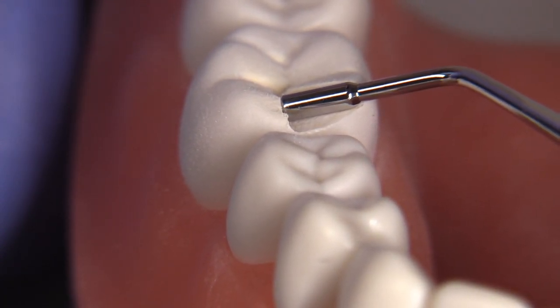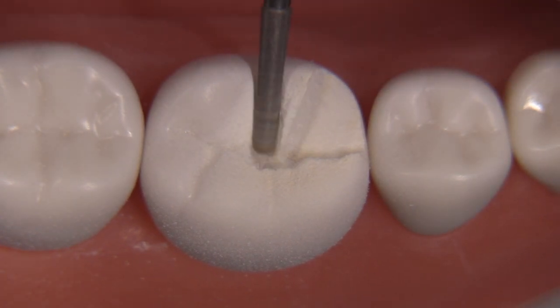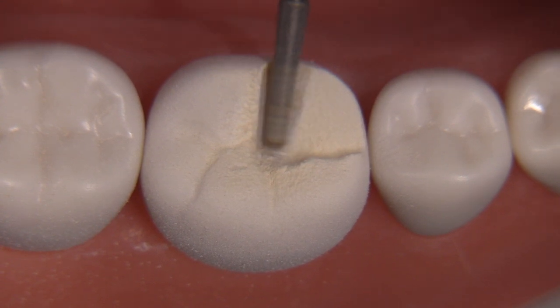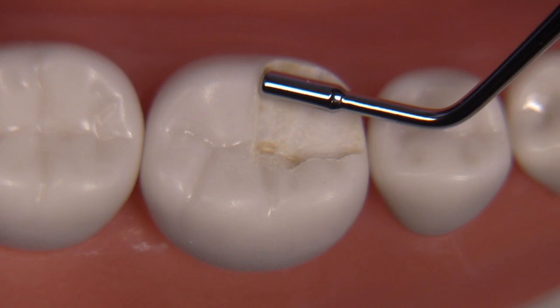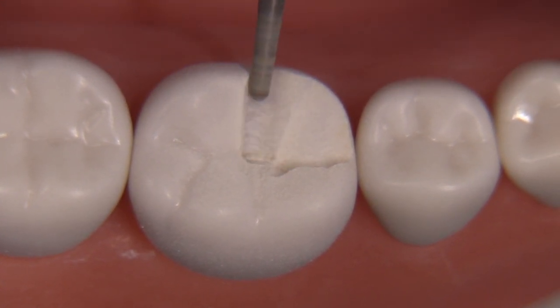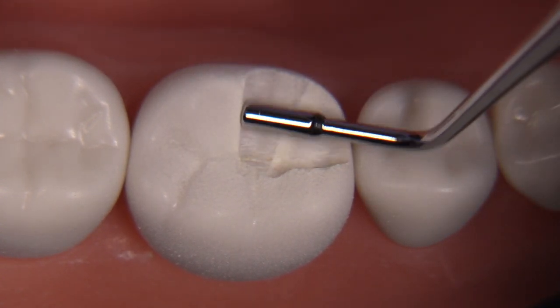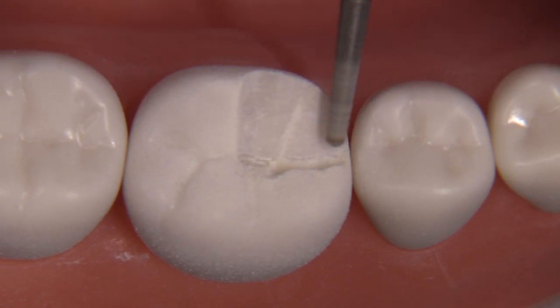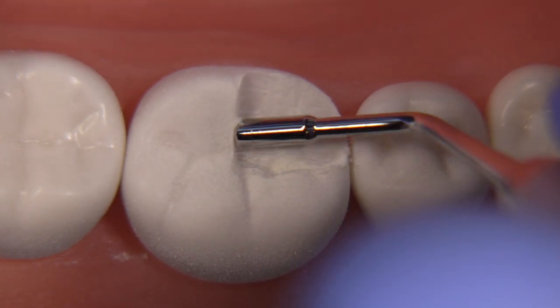With the PFM we're looking at 2 millimeters of occlusal clearance when we're finished, so a 1.5 millimeter depth plane — not a depth cut necessarily, but a depth plane — is a very effective technique to get to that 2 millimeters. We just continue prepping and checking. You can see here that we're just a little bit under-reduced, so we'll go back and reduce a little more and verify with the RGS4. There are numerous ways to check occlusal clearance: putties, matrices, wax, bite registration tabs — but I find it easy to use this instrument with a known measurement.